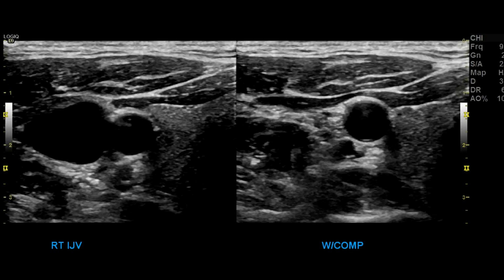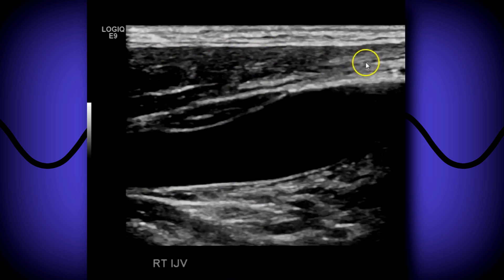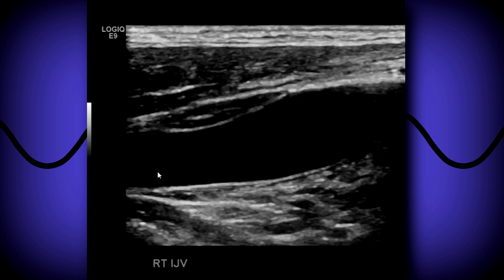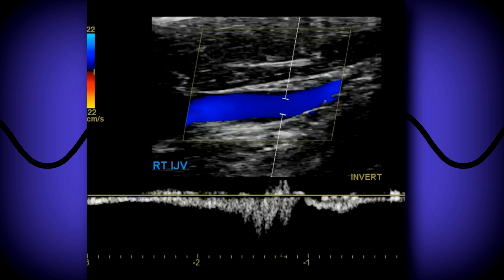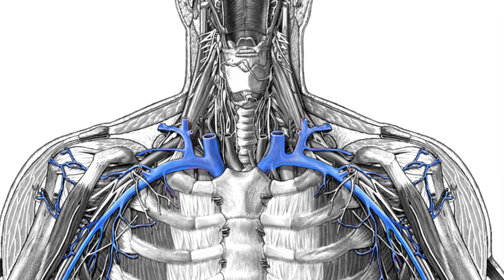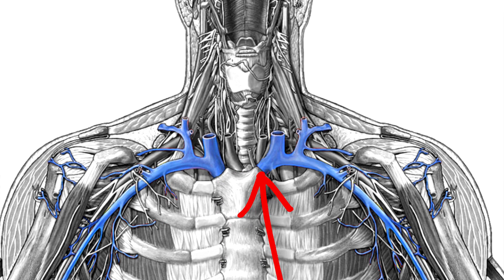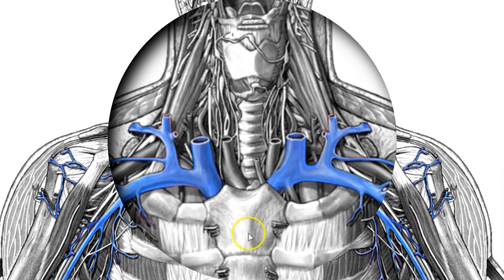The jugular vein is easily collapsible and you might have to use less pressure. In the sagittal view, you see the muscle and then a nice clean jugular. A lot of times you might have some reverberation artifacts — use your TGCs to clean those up and give a nice clear vessel. With color, you'll see it fill up nicely, and finally perform spectral wave analysis.